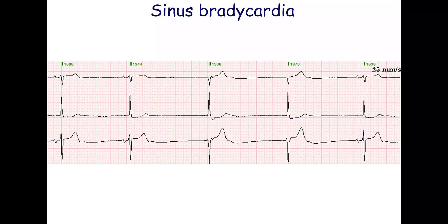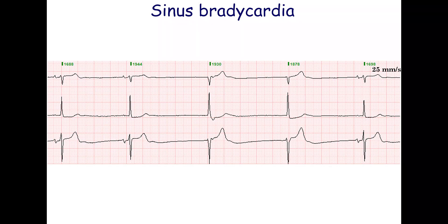Note the 3rd and 4th QRS complexes that are not preceded by P-waves. They are of junctional origin. Sometimes, several escape complexes may occur in a row without a sinus beat. These complexes form a rhythm.